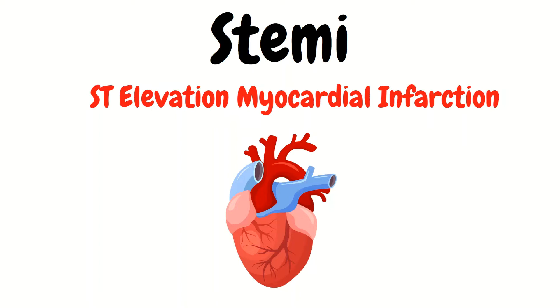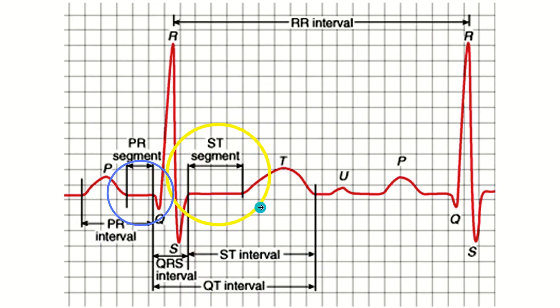First we need to know what the ST segment is, since STEMI stands for ST segment elevation myocardial infarction. The ST segment is the section encircled in yellow on screen. Note how it is similar to the PR segment in that it's kind of just a straight line. This is the ST segment, and this is the PR segment. It's important to know where the PR segment is because we're going to compare them when looking for ST segment elevation — the ST will be elevated above the PR segment.